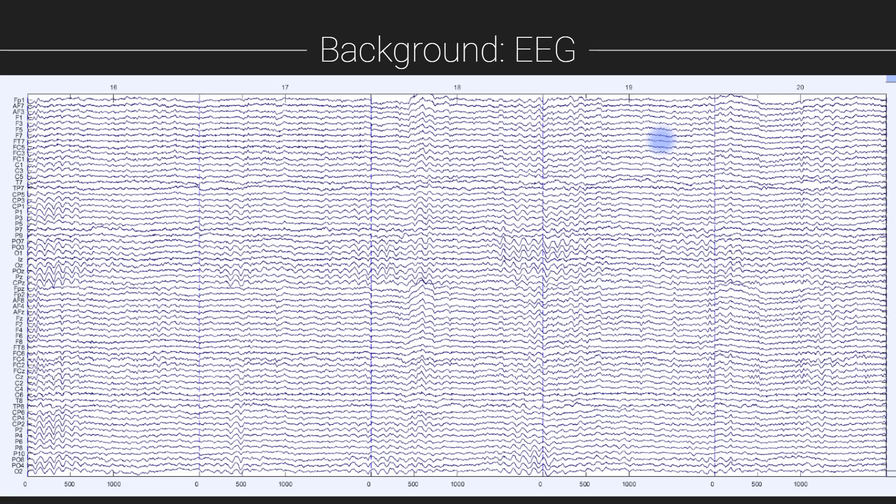Here you see an example of EEG data. So each row, each wiggly line in this image corresponds to the voltage fluctuations from one electrode, one data channel. So you can see that there were several dozen electrodes that were recorded simultaneously.